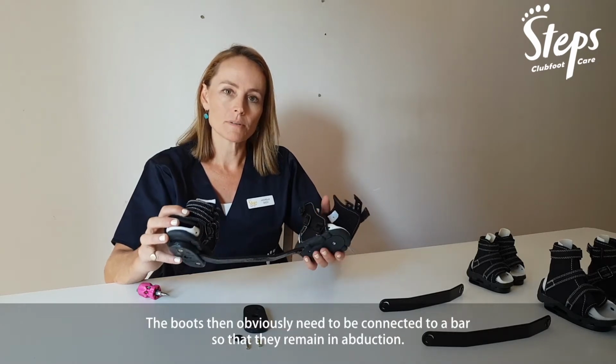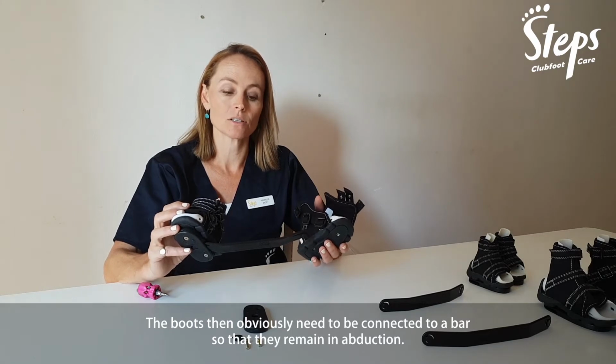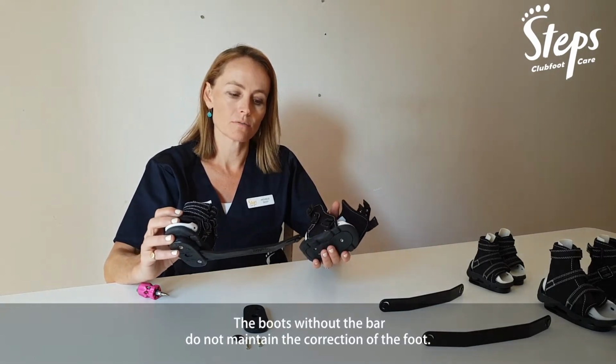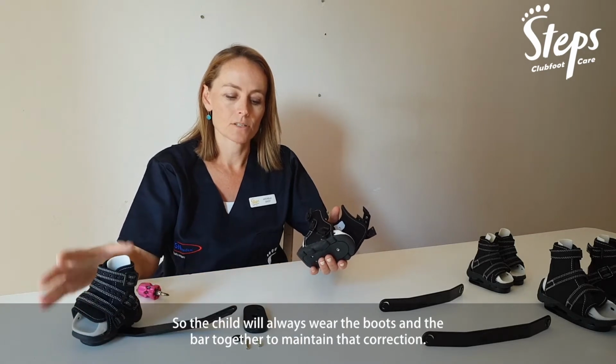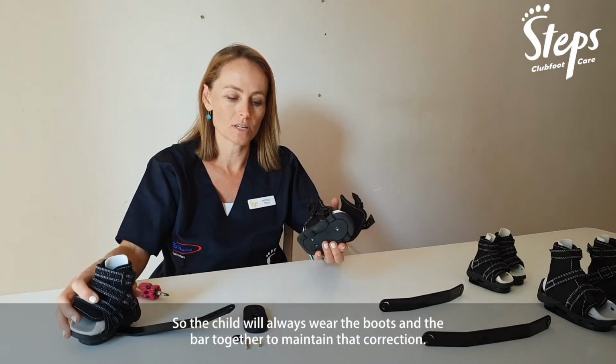The boots then obviously need to be connected to a bar so that they remain in abduction. The boots without the bar do not maintain the correction of the foot. So the child will always wear the boots and the bar together to maintain that correction.